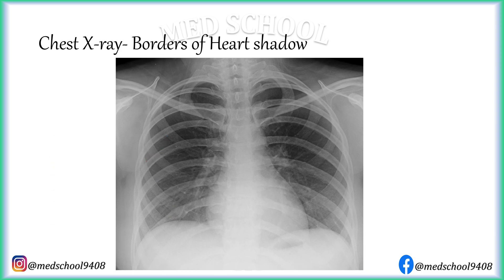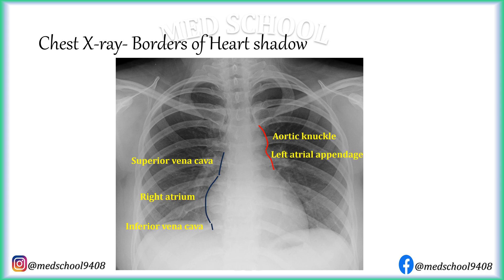Heart occupies the central part above the diaphragm. The right border, from above downwards, is formed by the superior vena cava, right atrium, and inferior vena cava. The left border of the cardiac shadow from above downwards is formed by the aortic arch — also called the aortic knuckle — then the left atrial appendage and left ventricle.